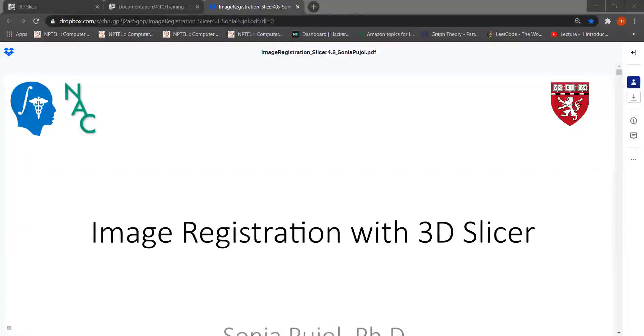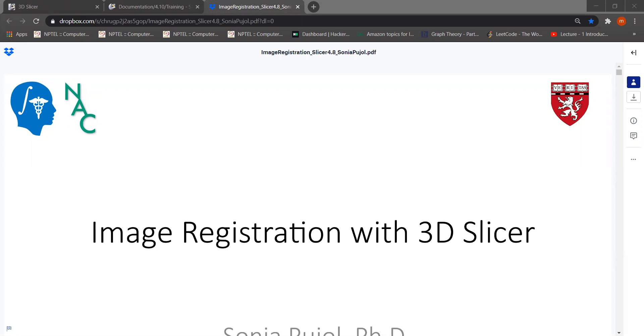Hello everyone, I am Milen Krante, 4th year BTEC student. As a part of medical image course project, in this tutorial today I am giving a demo of image registration with 3D slicer.